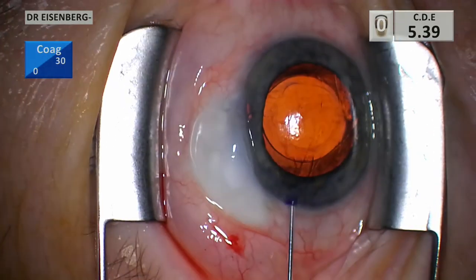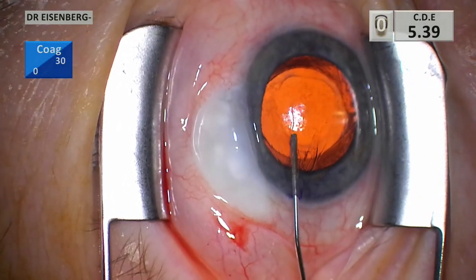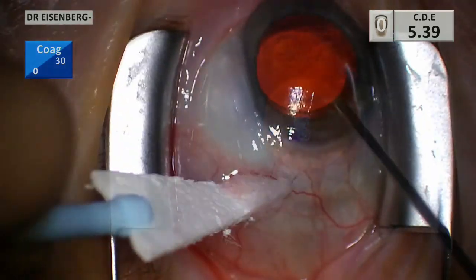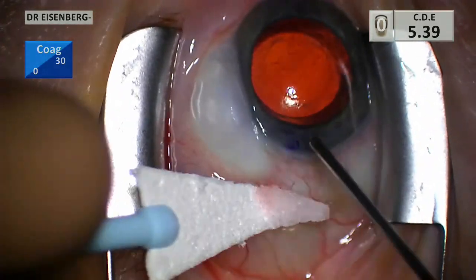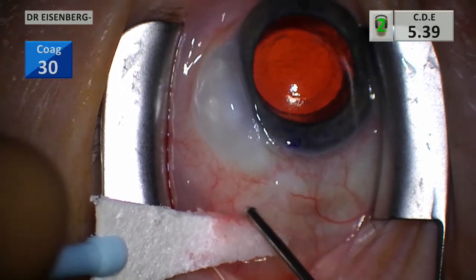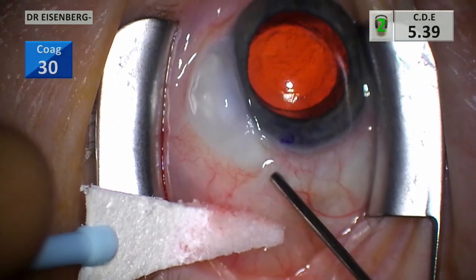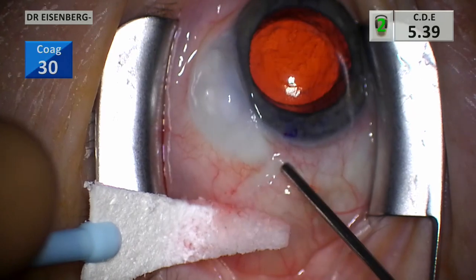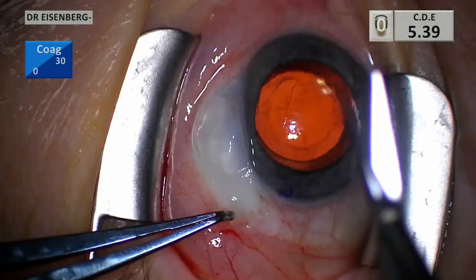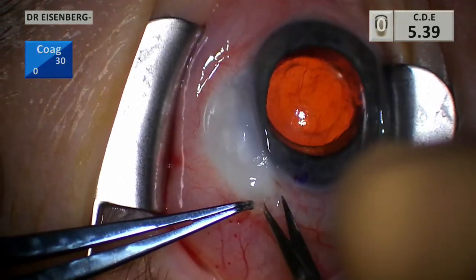Here you can see me putting in the subconjunctival anesthesia — that's two percent lidocaine. In this particular case I did use Provisc viscoelastic to inflate the AC because the eye had completely collapsed thanks to this bleb leak. Very often I don't; it kind of depends on the status of the anterior chamber. I do like the viscoelastic because it helps keep the bleb inflated when I do the subconjunctival pass.